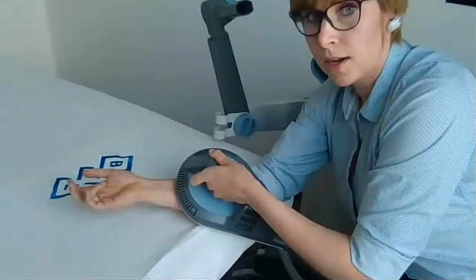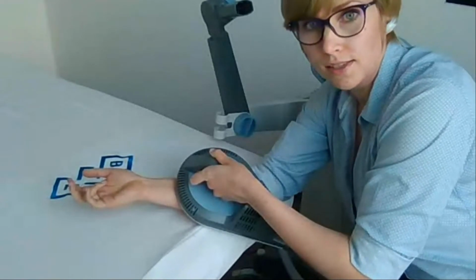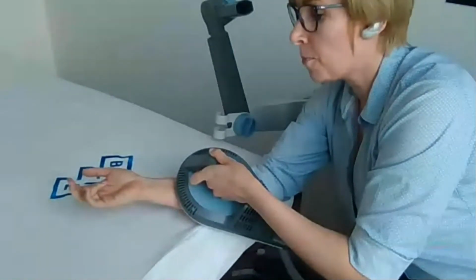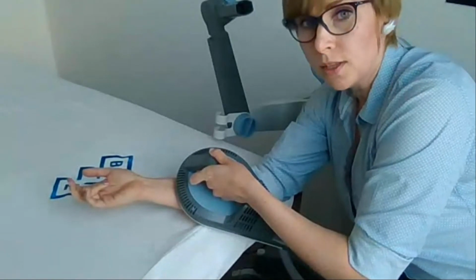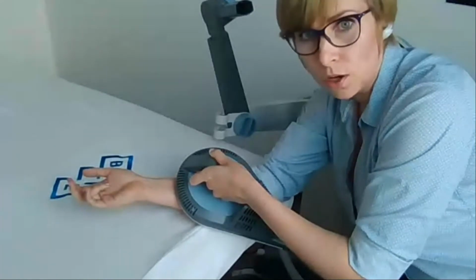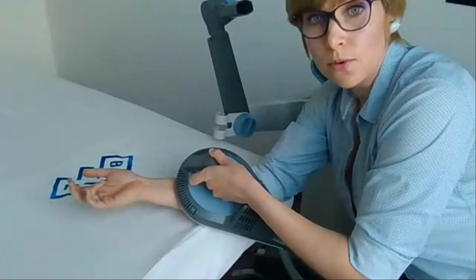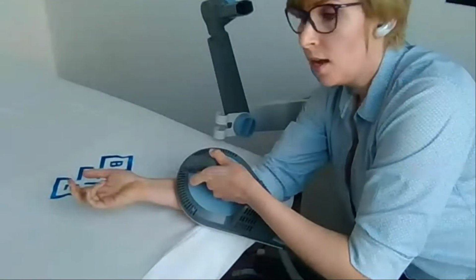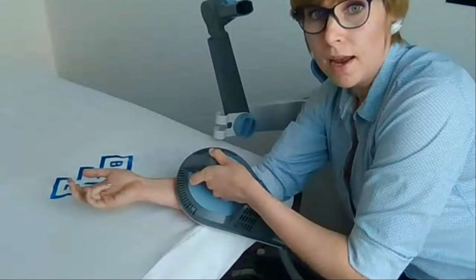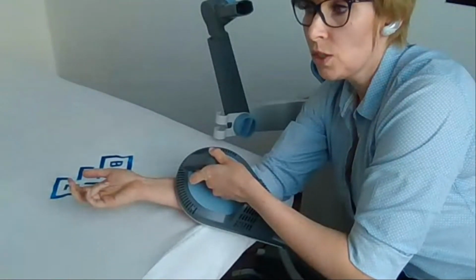So as you can hear now, right now this is the third section of 7 in the sequence in this protocol. Usually the protocols are around 10 minutes. Some of them are a little bit longer, some of them a little bit shorter. So the protocol is very simple and very easy to adjust, and very easy to set.